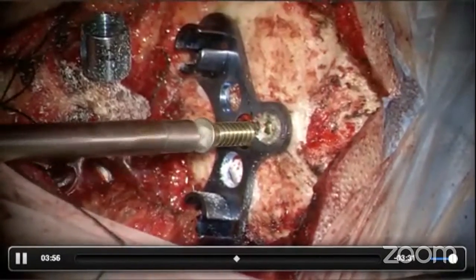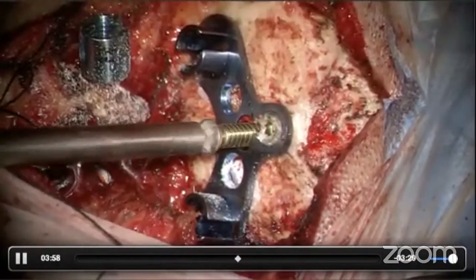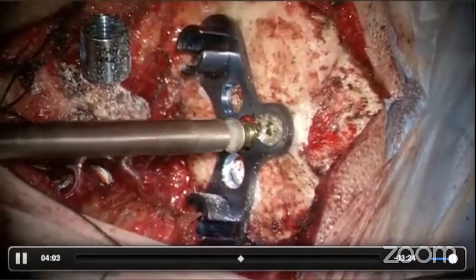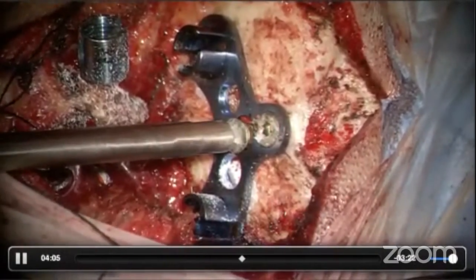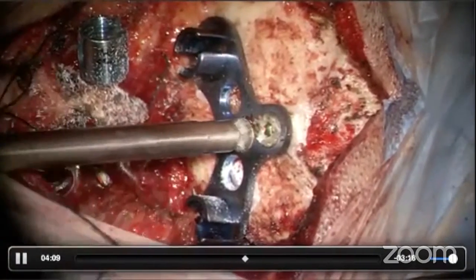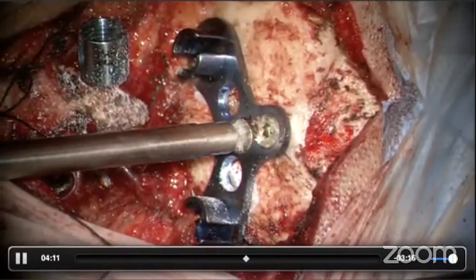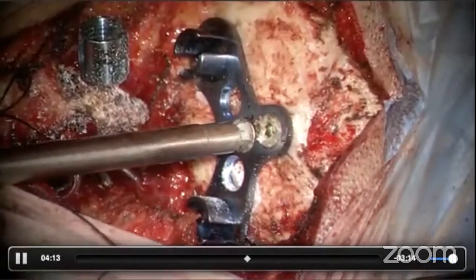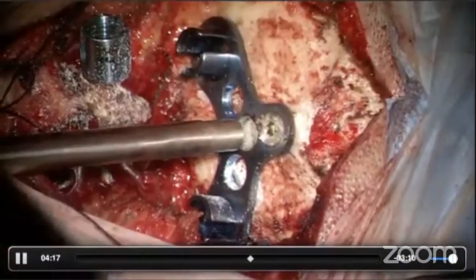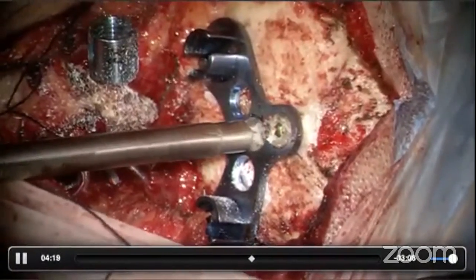If the screw does not grab the bone or does not advance, do not push it in with force. This never works and the screw threads that you have tapped will strip away. Instead, gently remove the screw and tap the hole again. Typically in the midline, the skull is so thick that you will feel the screw grabbing the outer table and the inner table separately.